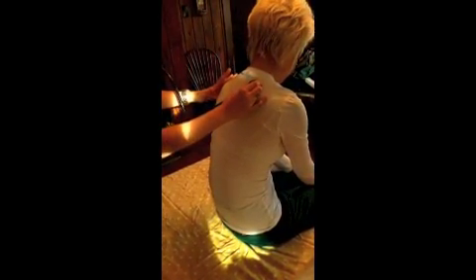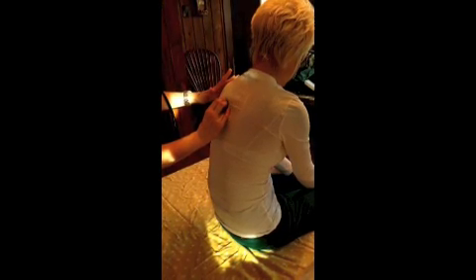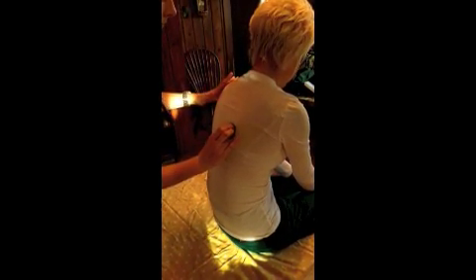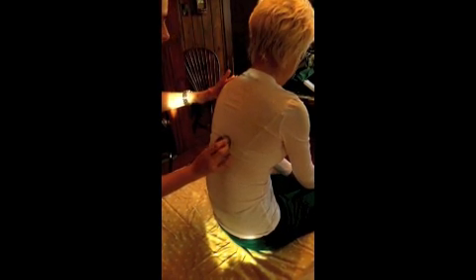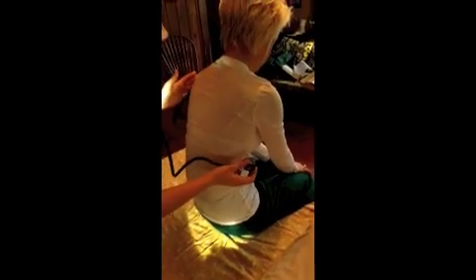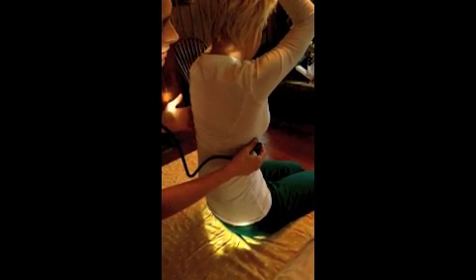Can you take some deep breaths, please? And I'm going to use a Z pattern as I move down her back. And then I'm going to listen to the 2nd, 4th, and 6th spaces on her lateral breath sounds. If you could put your arms over your head for me. And some nice deep breaths.